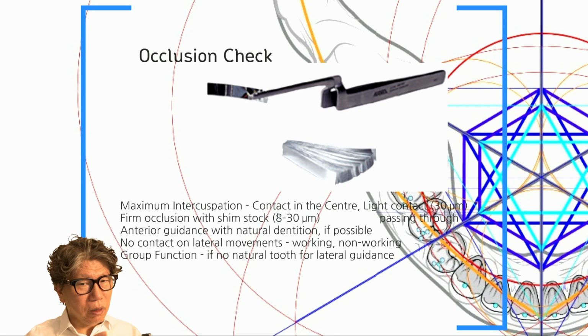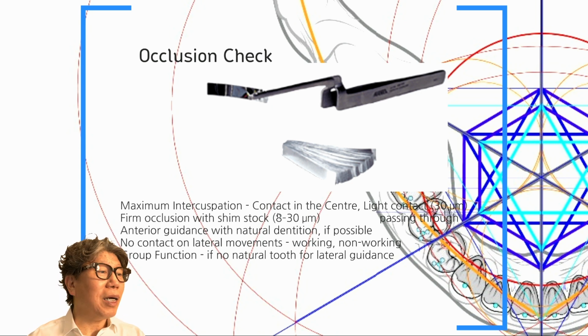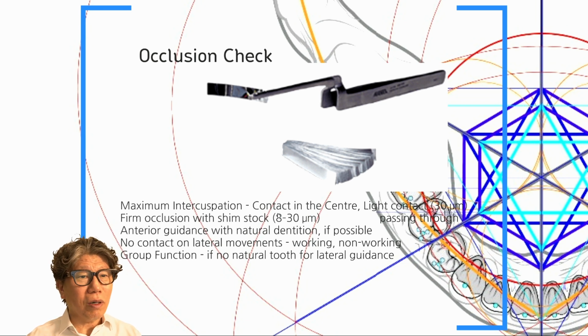Without a strategic and qualitative evaluation, it remains impossible to know forever. One should not rely solely on one-dimensional thinking, such as high or low. You cannot discuss implant occlusion with simple judgments of high, low, or the same. So take the bite registration accurately, strategically analyze and carefully examine the nature of how it was captured, and by comparing them, you can understand what treatment I provided and how the patient feels.